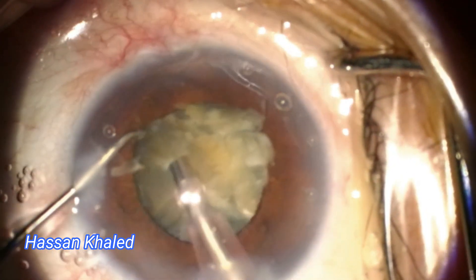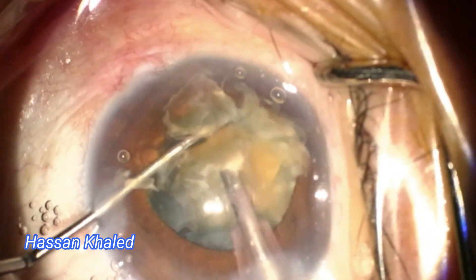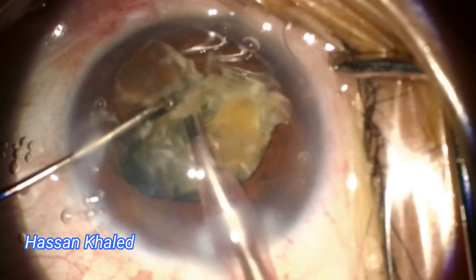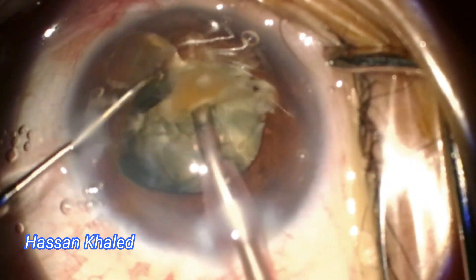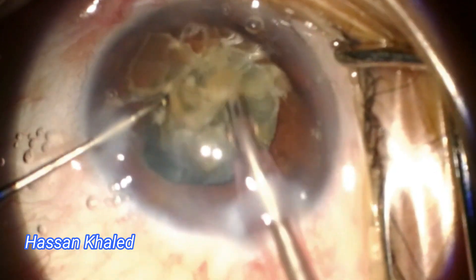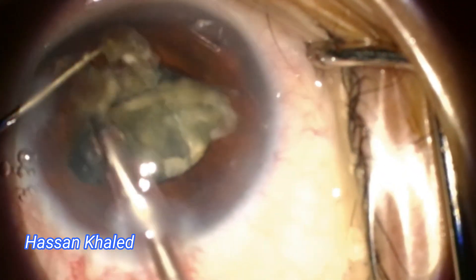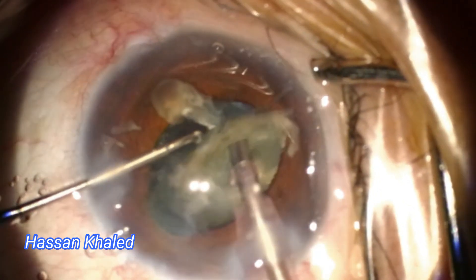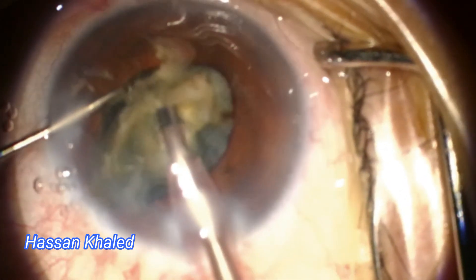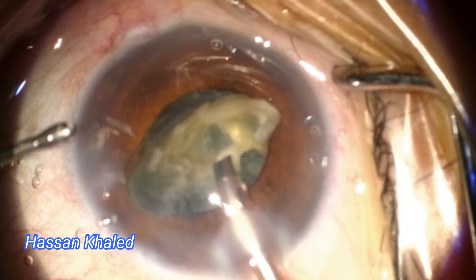Also, look at the pupil — it starts to constrict during emulsification of this dense cataract. One important point: as we are chopping and emulsifying this dense cataract in the anterior chamber, it is very important that we inject dispersive OVD while emulsifying this dense nucleus to protect the back of the cornea, as we can see.